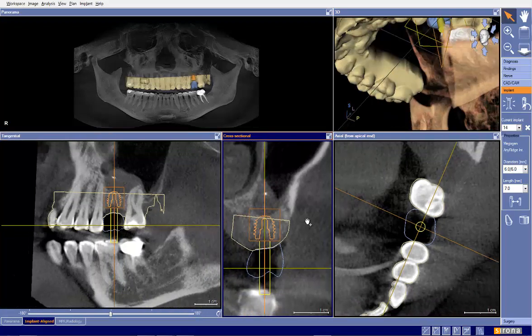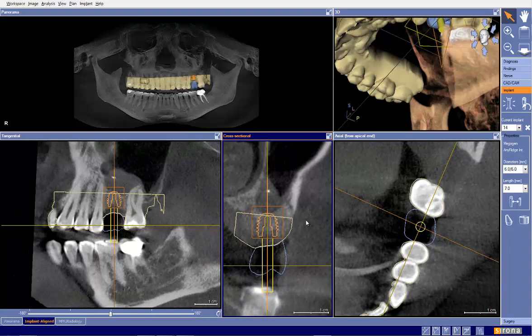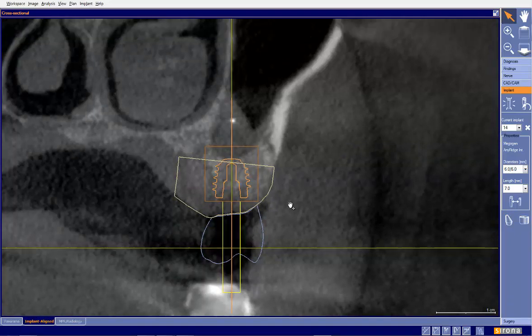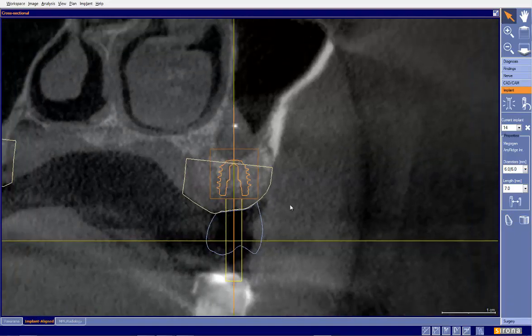Now the bigger question in this, and the big question that was asked here, is more about the sinus. I personally have not used the Megagen Any Ridge. I do know that it's a very good implant that's nice and aggressive. This will bump up against the floor of the sinus. So what I would recommend in this case is drilling a little bit short and doing a small osteotome, pushing up the sinus a little bit, pack a little bone in there, and then drive the implant in.